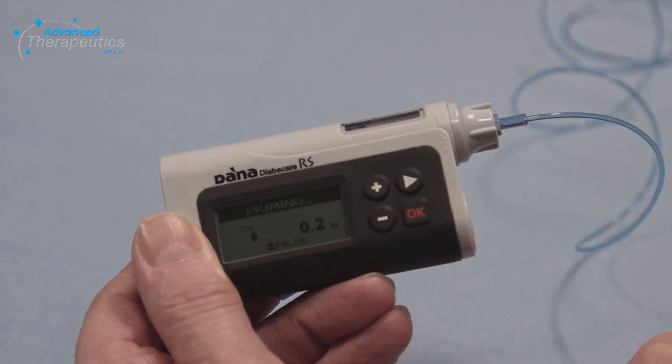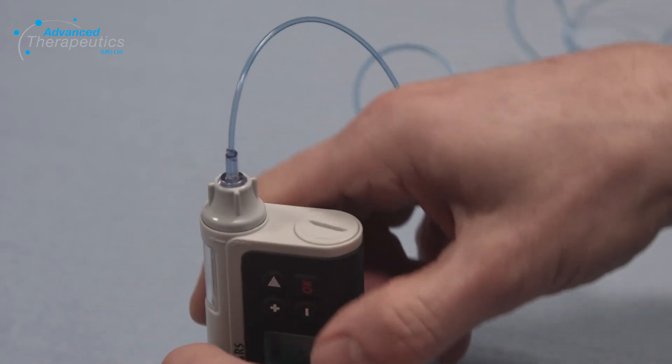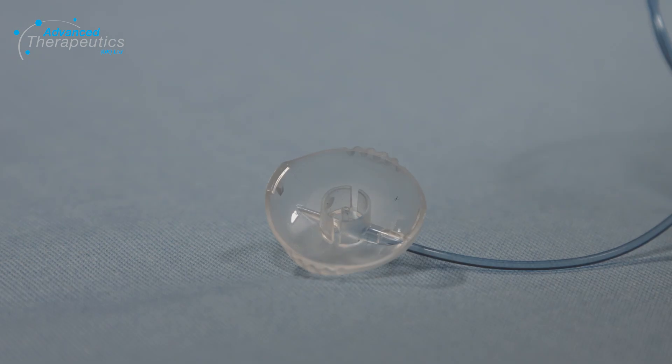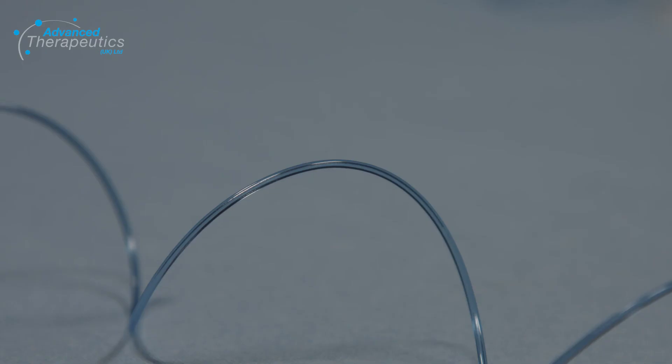You will see the prime start. Place the pump upright. Watch for the insulin passing along the tubing and ensure any bubbles are primed out. When 3-4 drops of insulin are seen at the end of the tubing, press the minus button to stop the priming and then press the minus button again to exit. A 60cm tubing will take around 14 units to prime.